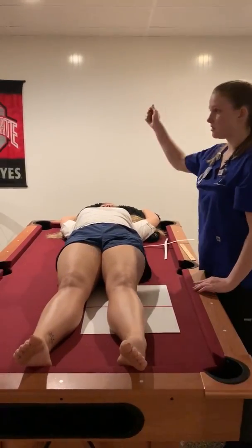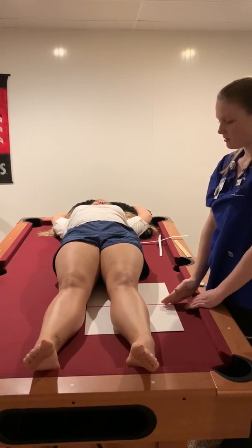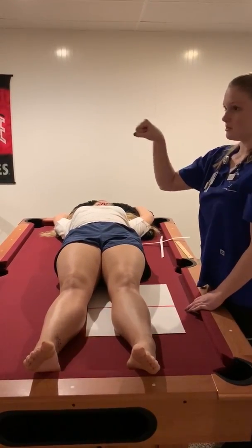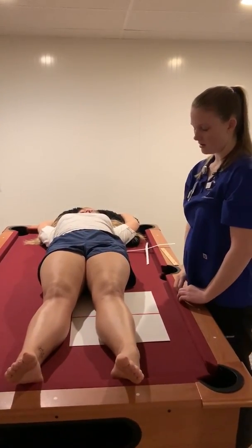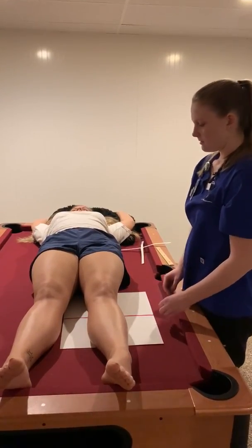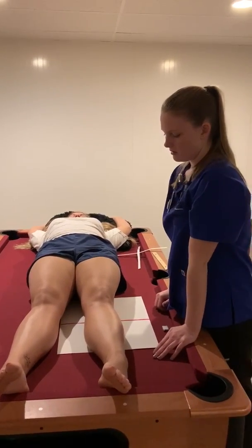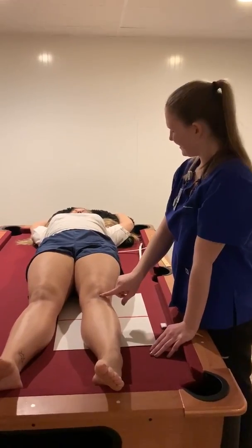So then I would just bring it down here, make sure that the tube lines up with the IR and the bucky, and make sure it's still in detent transversely, and still at an SID of 40 inches. And then for the knee, you're going to center a half inch distal from the apex of the patella.